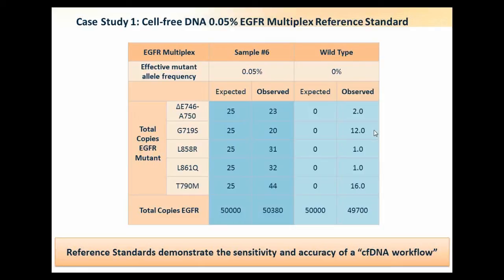Altogether, I think that this blend is pretty important, because we know that when we're talking about cell-free DNA monitoring, it is very important to be able to detect the low allelic frequencies. So this is very much relevant to the physiological and also to the clinical samples.